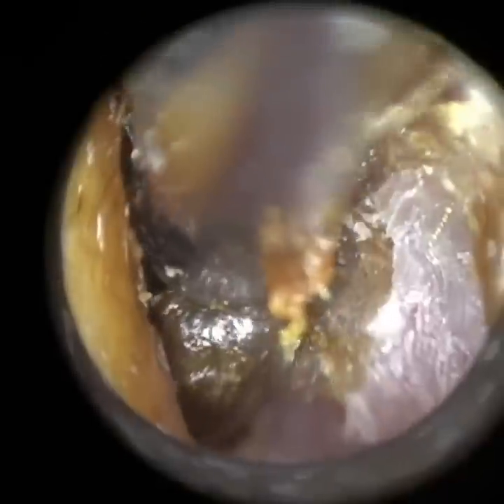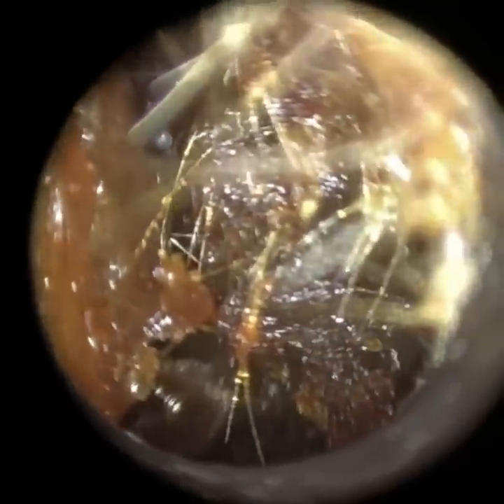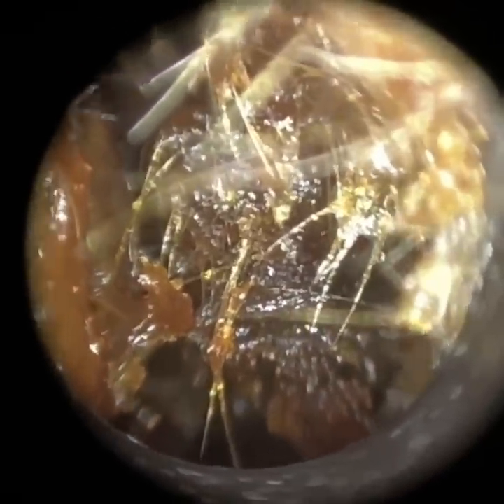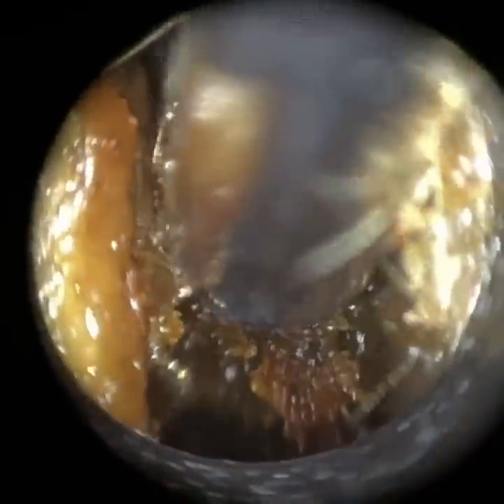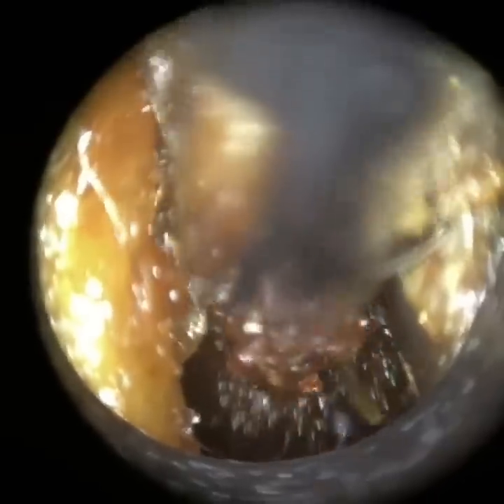The wax then tries to move out of the outer third of the ear canal and exit the ear, but it's the first and second bend — because it's narrow — where it can get trapped. If you release it from the back wall of the first bend, it does help almost separate the wax plug, because that is probably the most common area where you need to separate the wax before it comes out. It can also be a bit of a blind spot just past the first bend. So we've got the more outer wax out — this is more medial. Just to the left, you can see that's the second bend, with a bit of skin just coating that. It's a tight squeeze with the suction probe — the Zoellner suction probe I'm using here.